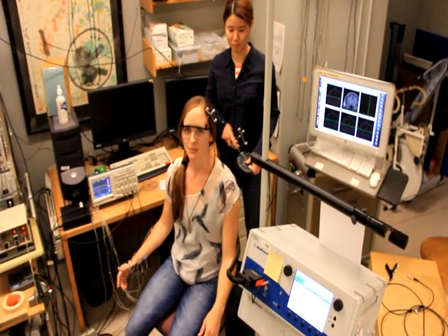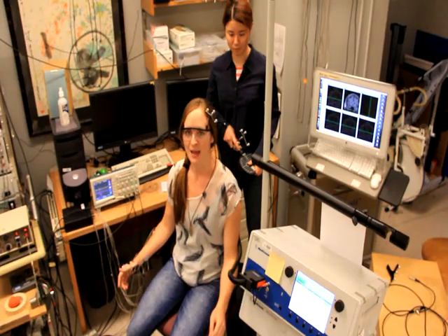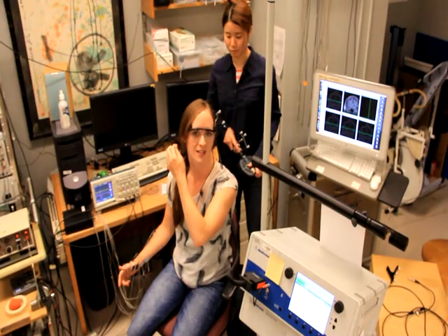Now what we're going to do is move that magnetic coil over the span of my motor cortex from one side all the way over to the next.